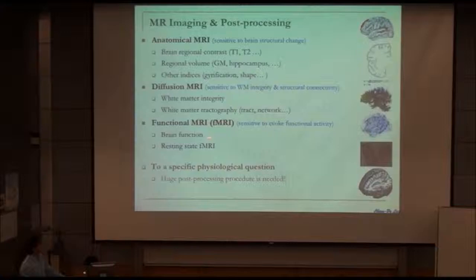We must have a very detailed or very solid statistic calculation to identify the regions. And here I also want to emphasize one more piece of information: different methods are sensitive to different information. That's very important.